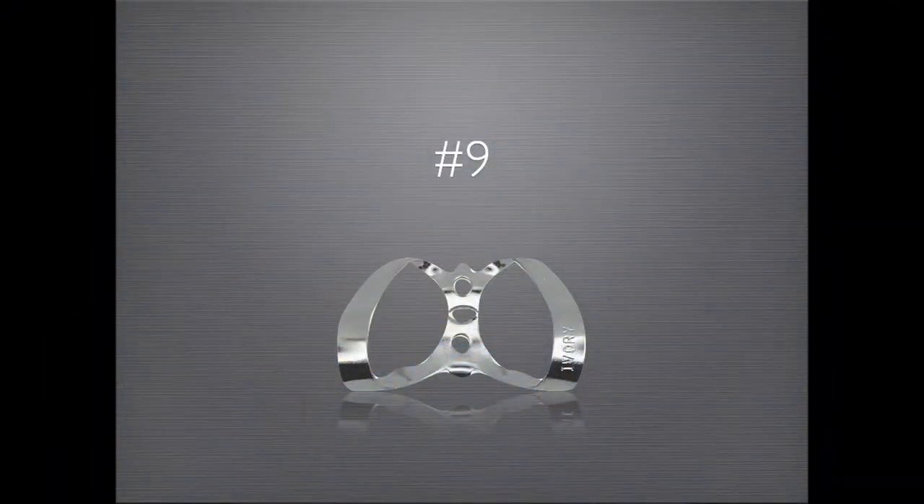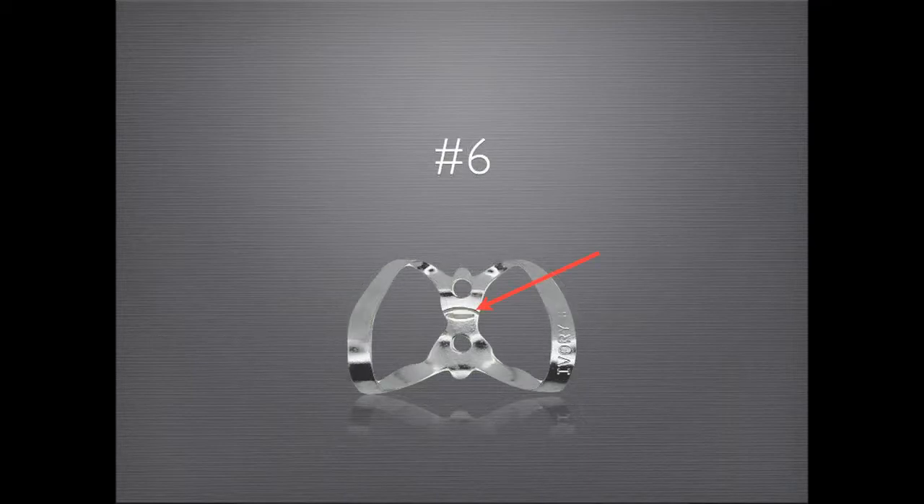The number nine clamp is an excellent choice for most anterior teeth. Alternatively, if a large canine or central incisor is encountered, you may use the number nine's sister clamp, the number six, which has a larger facial jaw. The number nine is placed in the following manner.